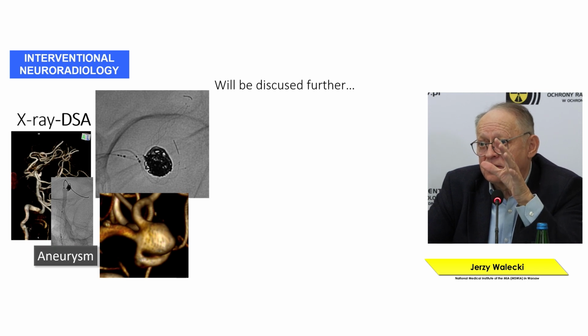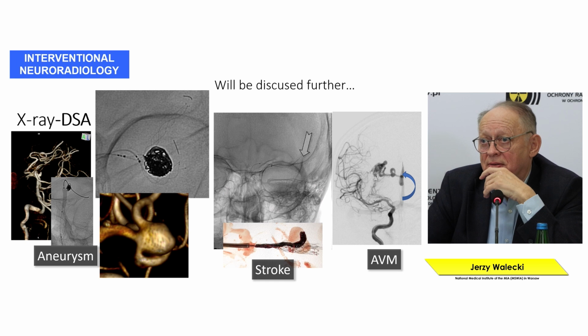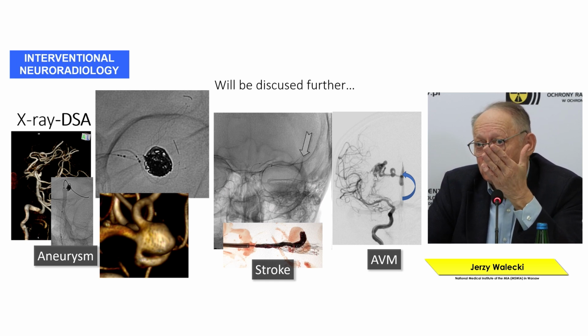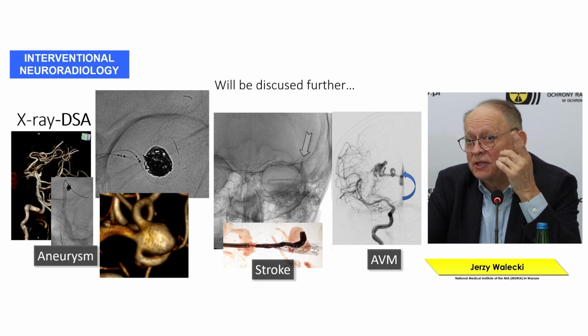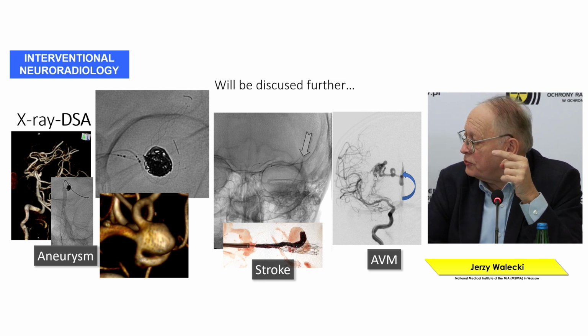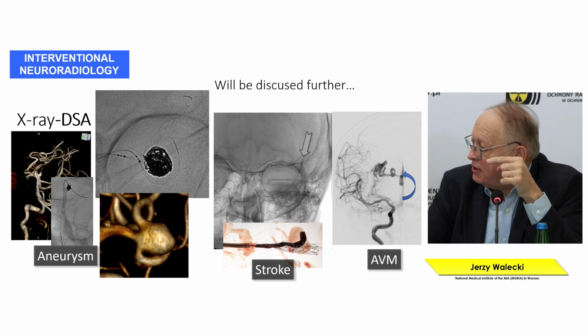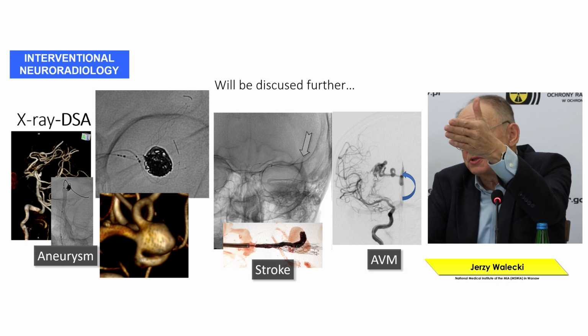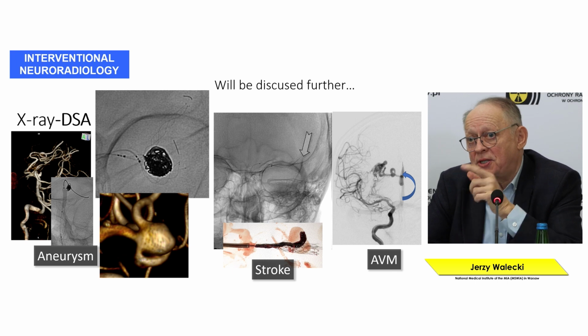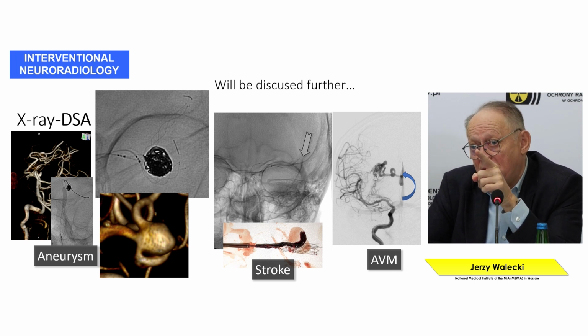So here you can see images from our everyday practice. They are quite impressive, especially in 3D reconstructions. Multiplanar reconstruction angiographs, they registered images, as you can see.